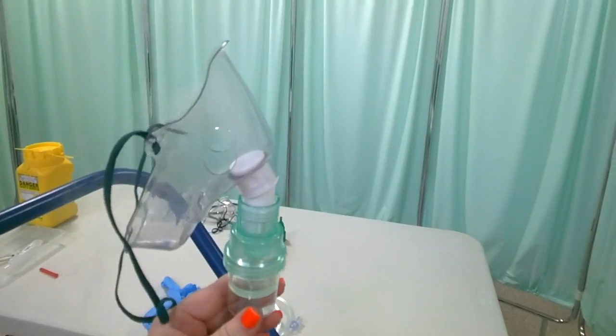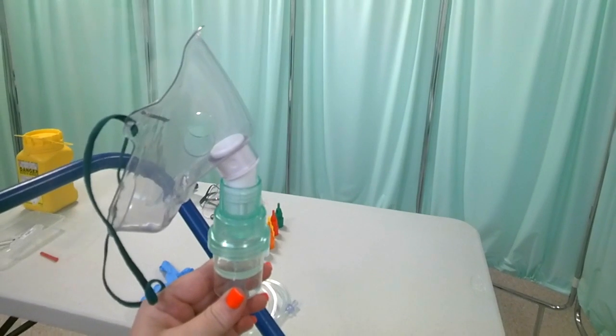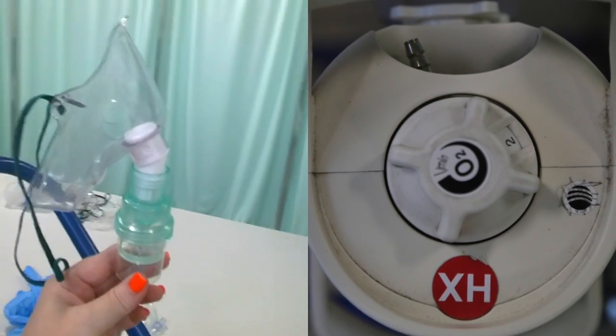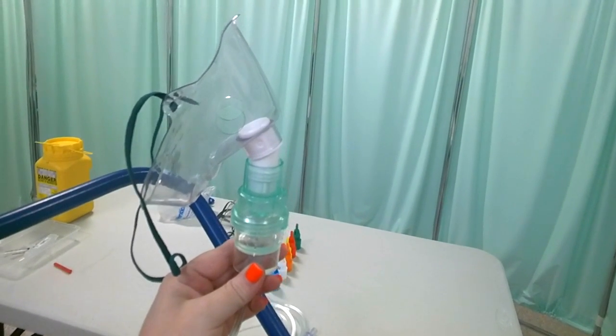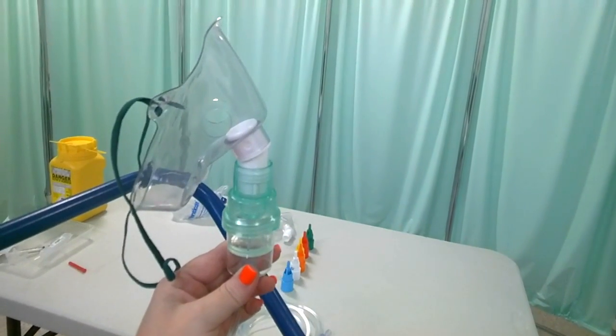Now, if we haven't run it at a sufficiently high flow rate, I'm just going to do this as an example, I'm going to take it down to 2 litres. You'll notice two things. One, the pitch of the sound is significantly lower. So that's your first thing to warn you that we're not getting any nebulizing action in the chamber there.